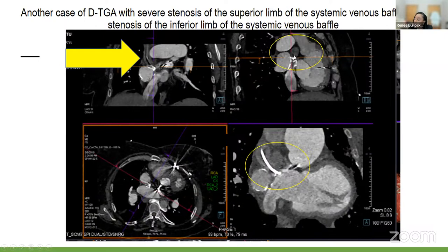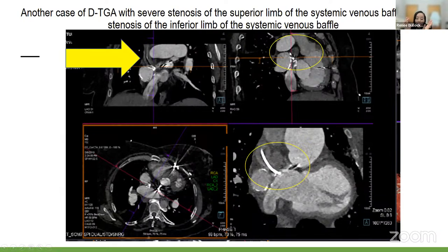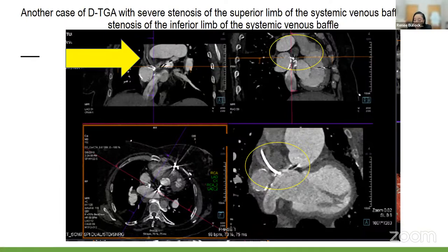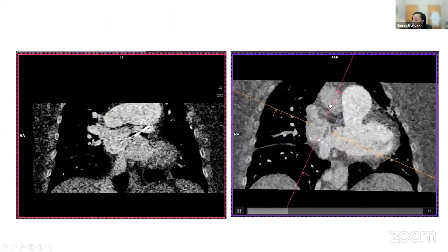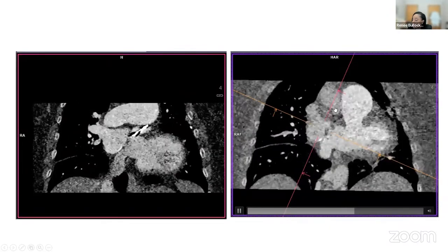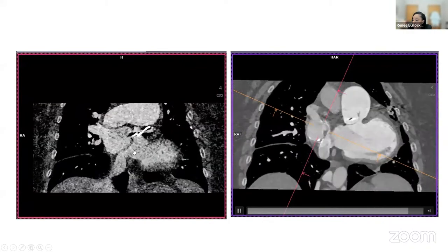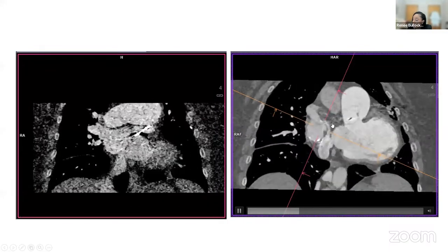Another patient had significant stenosis of the superior limb of the SVC baffle — there was a lead in the SVC and essentially no flow through it. She was referred for SVC stenting after presenting with facial swelling and shortness of breath. She required explantation of the lead and stent placement. This highlights an important concern in DTGA patients: baffle stenosis can occur when placing transvenous leads, as tissue forms around the leads and causes stenosis. There was also mild IVC baffle stenosis, but the main pathology was SVC stenosis.